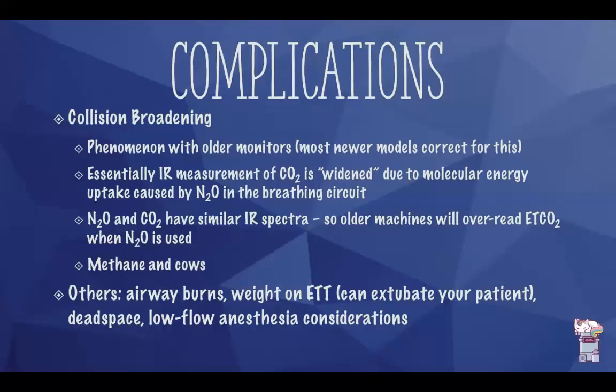Patients that are administered nitrous oxide can have an increase in the reading of their end-tidal CO2 if an older monitor, or one that doesn't correct for collision broadening, is utilized to measure end-tidal CO2. Since nitrous oxide and CO2 have similar infrared spectra, they will overread this end-tidal reading. A similar phenomenon happens with methane gas in ruminants, such as cows.